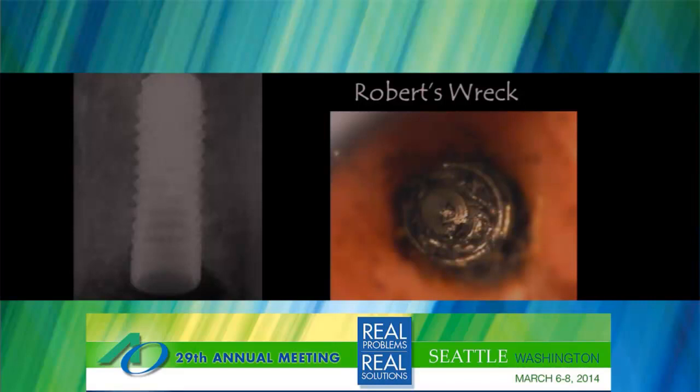Now, the image that you see on the right was taken through a microscope that I used for a couple years across the street in an endodontic office, and it had a video camera on it, and it would frame capture the video. So the image isn't quite as crisp as I'd like to see, and you'll see better ones as we progress on. But in this slide, this expanded view almost to pixelation, you can see on the lower right at about 5 o'clock there's one circle, and then up in the 10 o'clock area you can see this enlarged circle, this crop circle, and I'll annotate it for you so you can really recognize what's going on here.